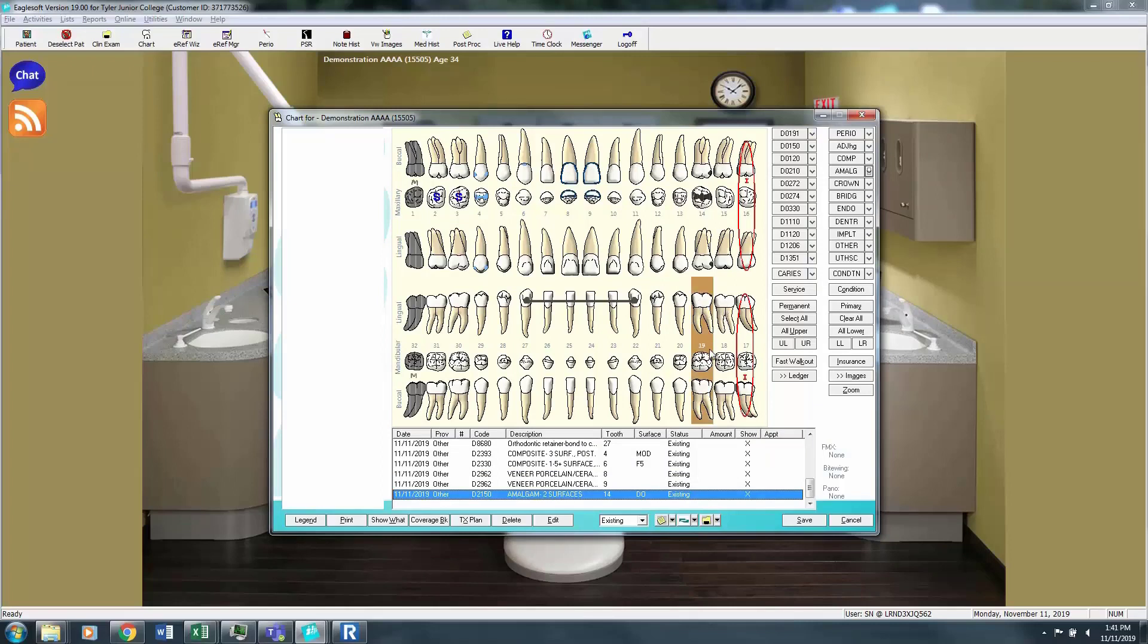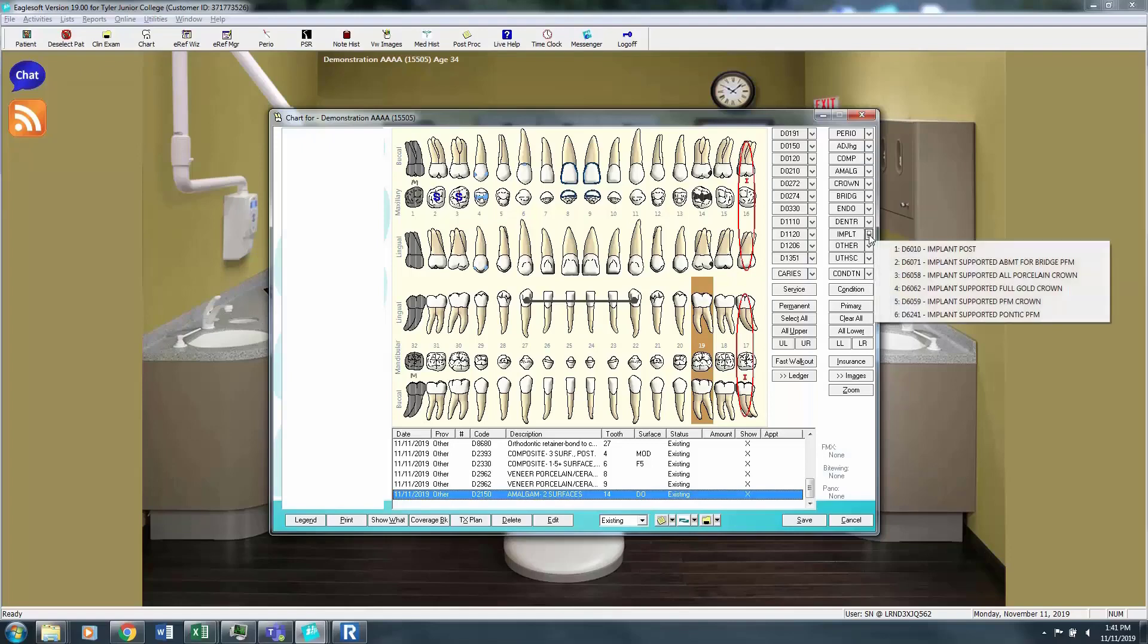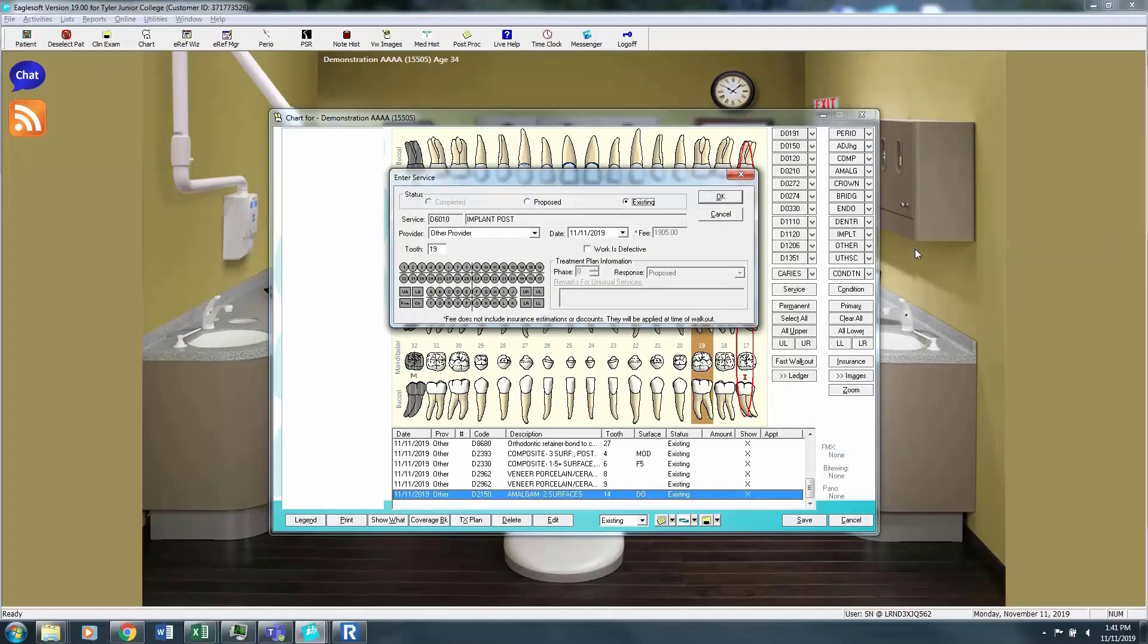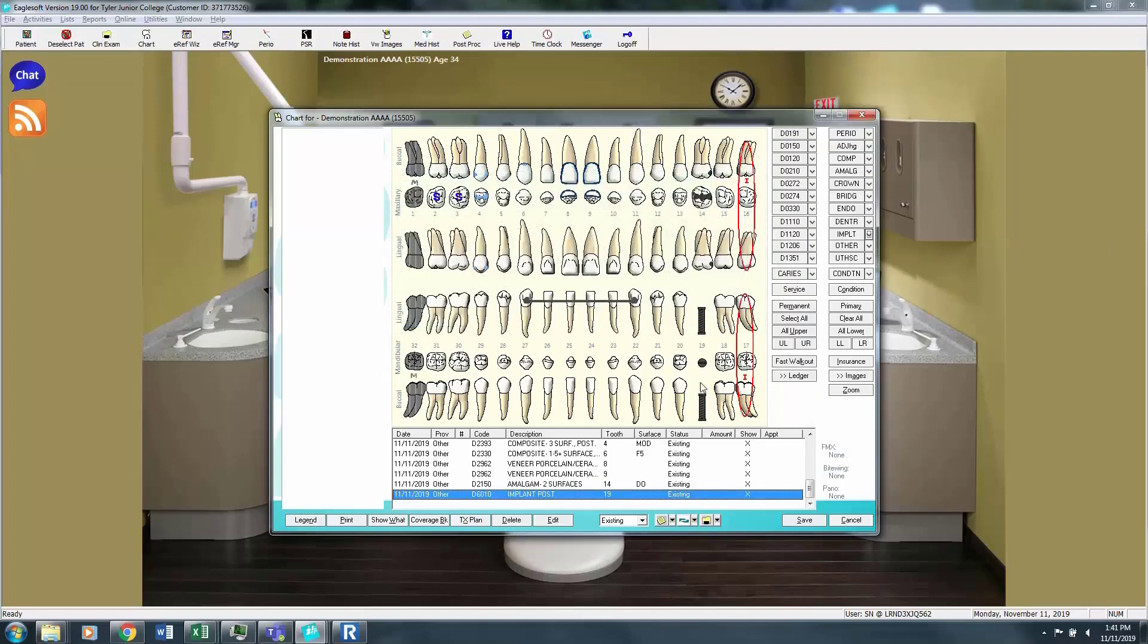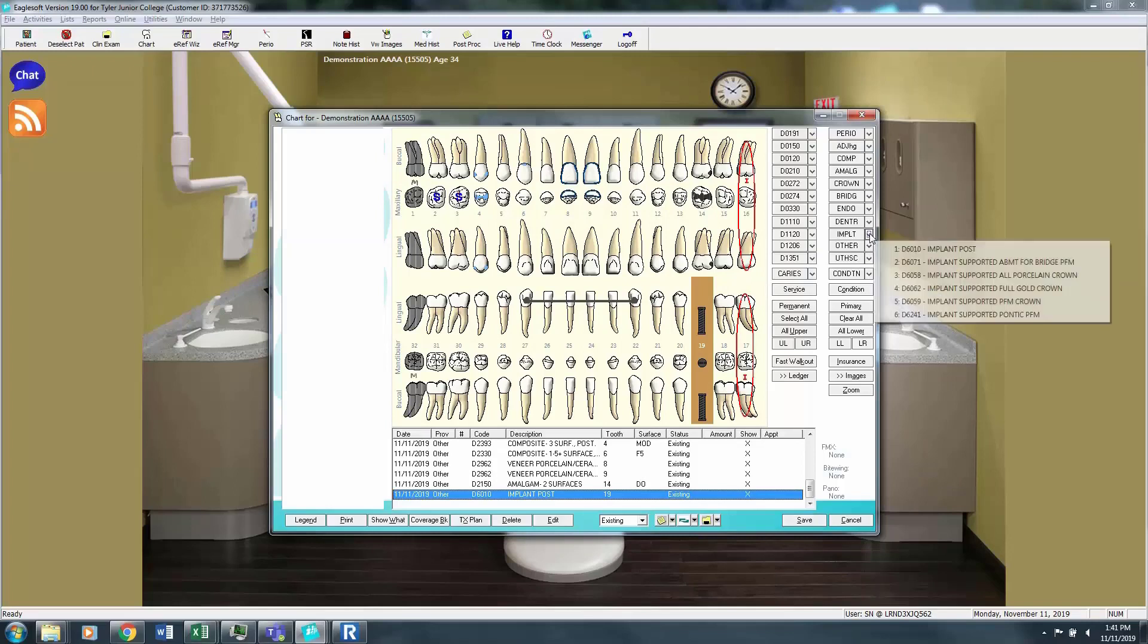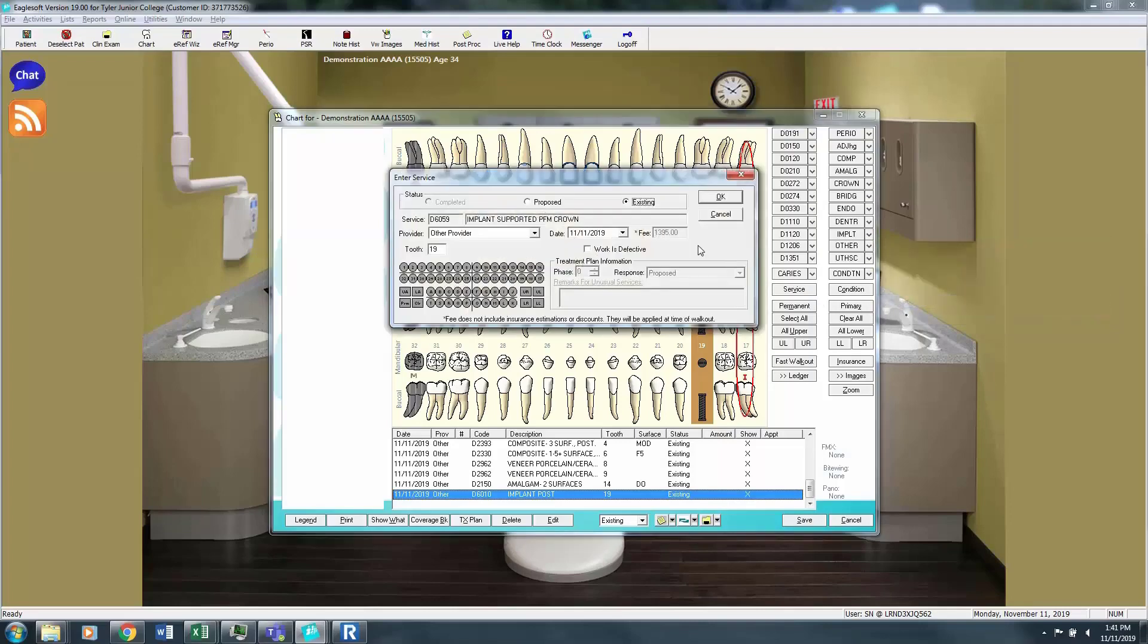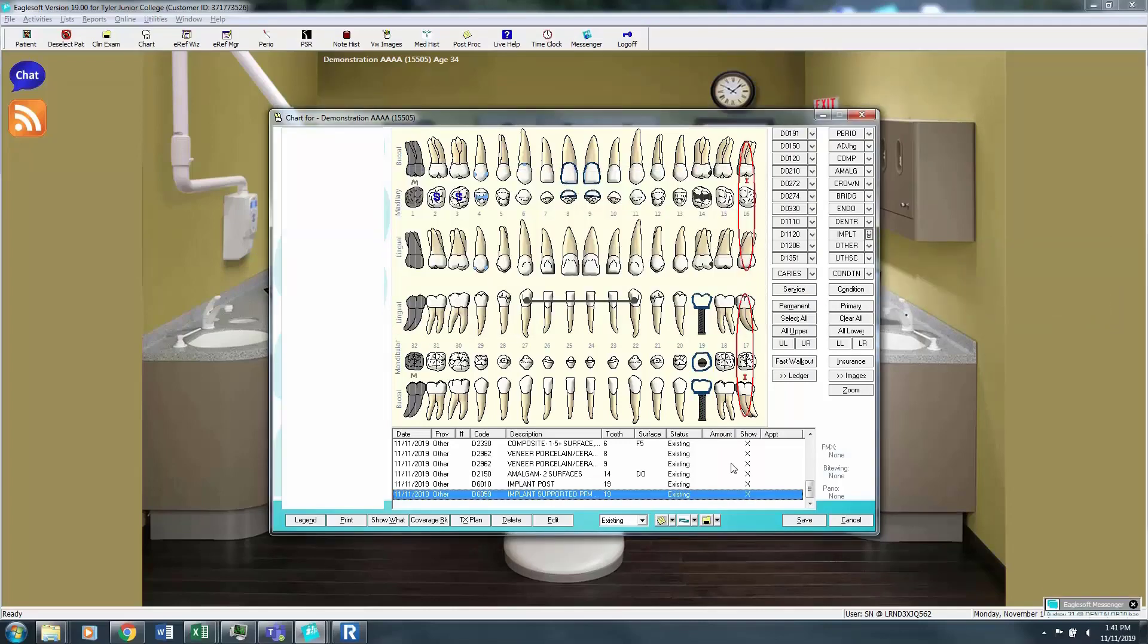Now let's do an implant. We'll say tooth number 19 is an implant. So we're going to click implant and we're going to put on the post. That will automatically take the tooth out. And then we're going to put an implant crown. We'll do a porcelain fused to metal implant crown. Those are very popular.